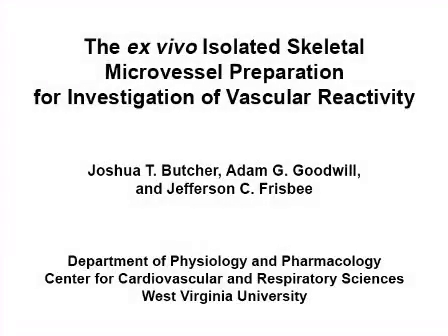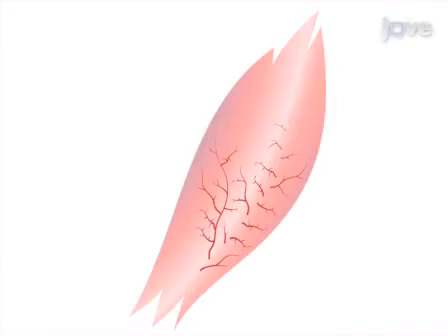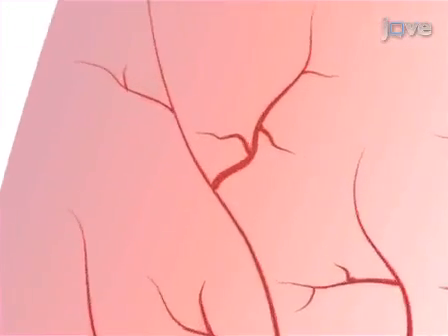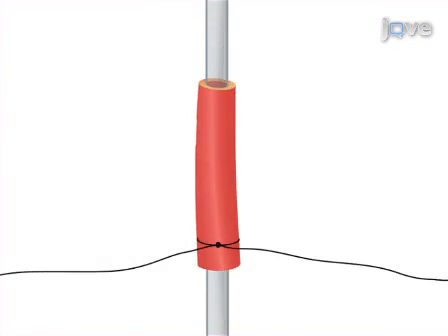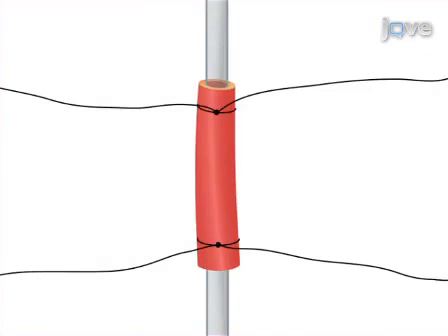The overall goal of this procedure is to surgically isolate, remove, and doubly cannulate individual resistance arterioles for study in an ex vivo setting. This is accomplished by first identifying and surgically isolating a microvessel in an anesthetized animal. After transferring the microvessel to a vessel chamber, the proximal and distal ends of the microvessel are both cannulated.